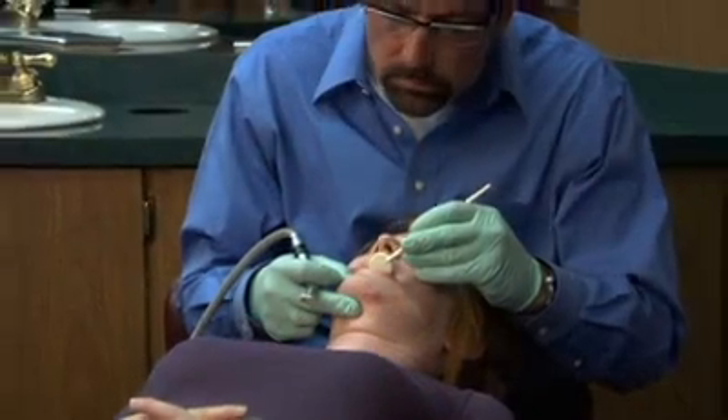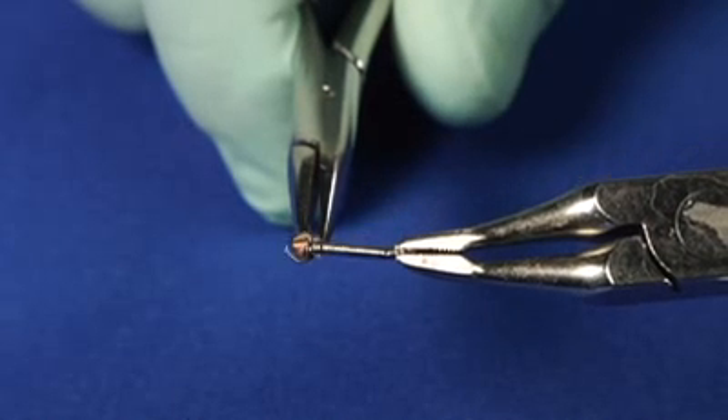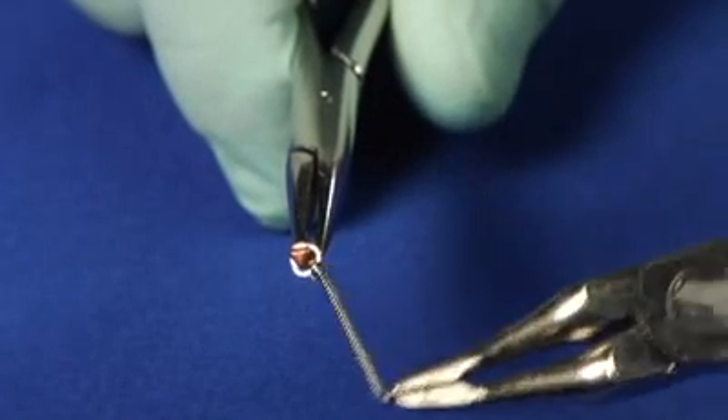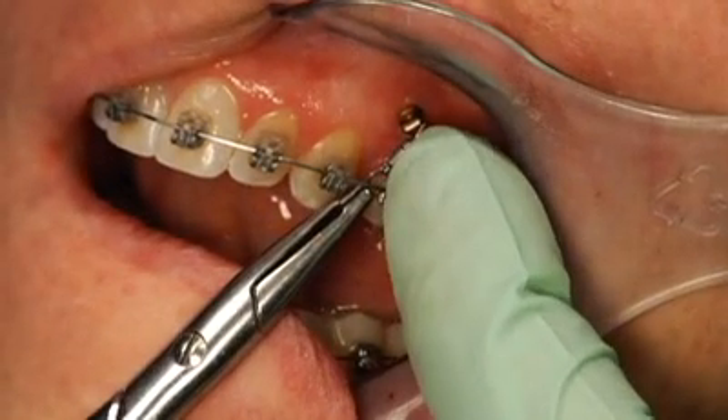You can then check the angulation using an occlusal mirror. Vector TAS offers a full range of springs and other auxiliaries developed specifically for the vectors and forces required in temporary anchorage.